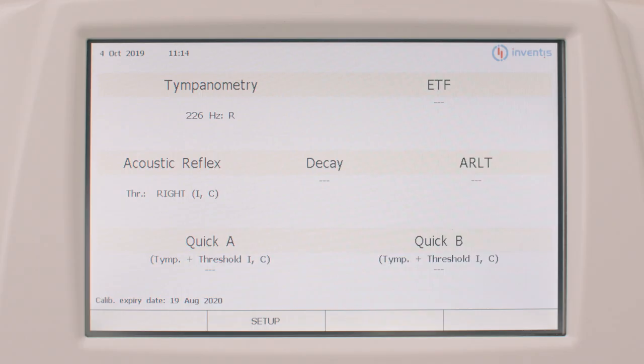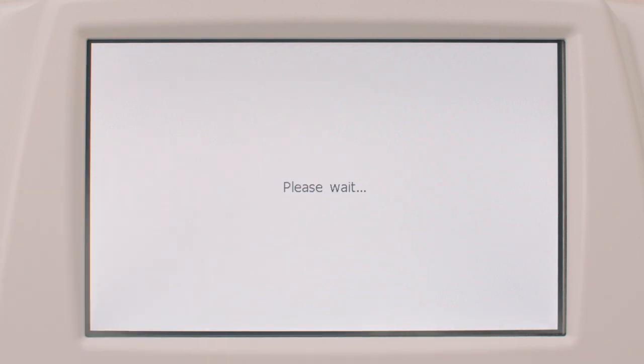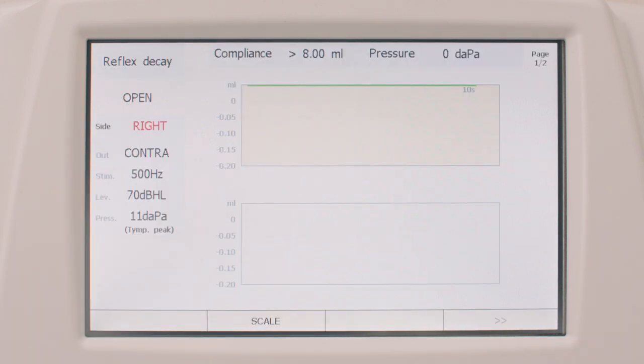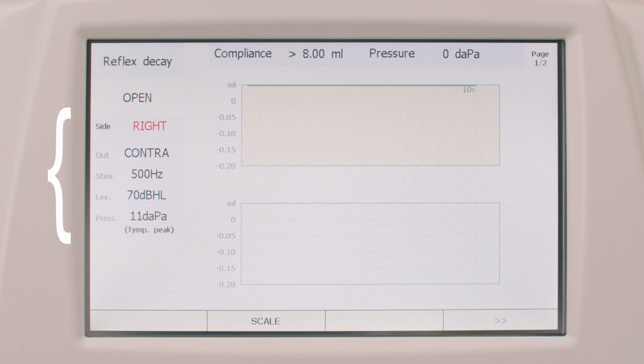In this video we'll have a look at how simple it is to carry out the additional tests available with the Clarinet. To conduct the reflex decay test the operator should simply press the dedicated button on the keyboard. The status of the probe and the progress of the tests are indicated at the top left of the screen. Lower down the screen shows information about the ear side being tested, the set ear canal pressure, and the characteristics of the current stimulus.